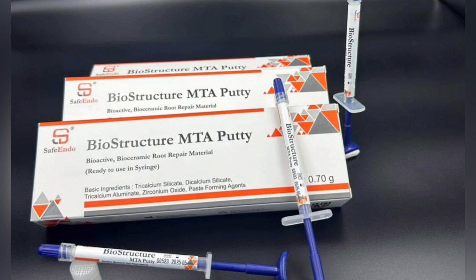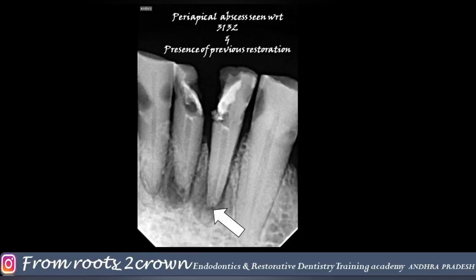Coming to one of my cases which I have done using this MTA putty material, a 75 year old female patient visited my clinic with pain and swelling in her left lower front tooth region. Clinical examination revealed a fractured restoration, and the mandibular left central incisor and lateral incisor were positive on percussion test.